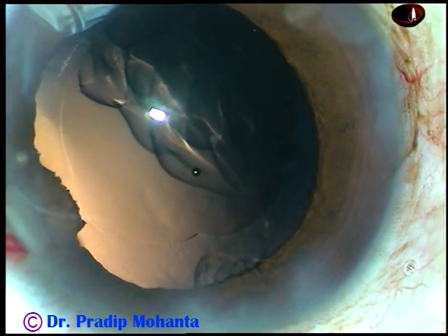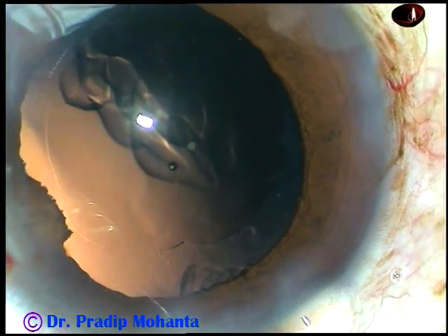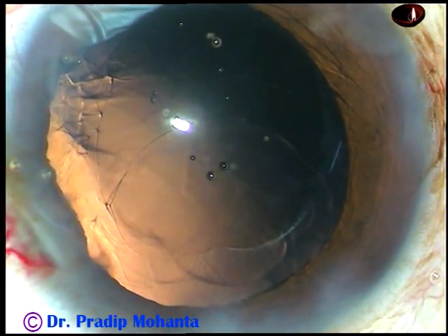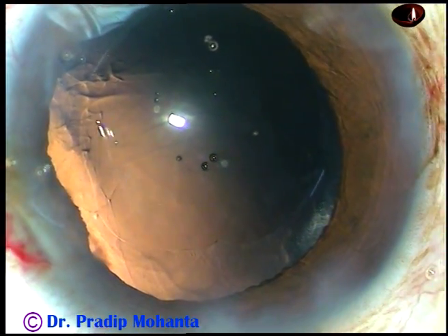Friends, in this video we are going to see how to put the trailing haptic of the intraocular lens into the capsular bag. After cortical clean-off, visco is injected into the anterior chamber and into the capsular bag.